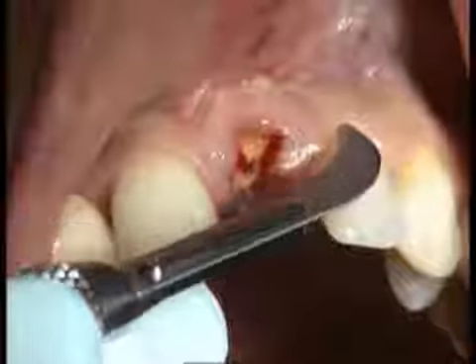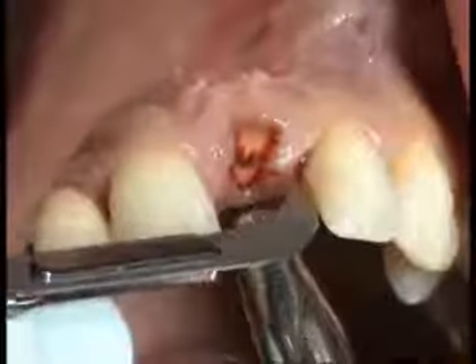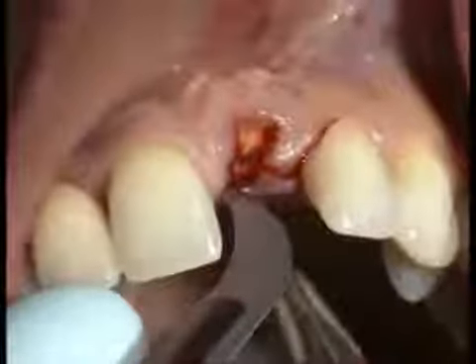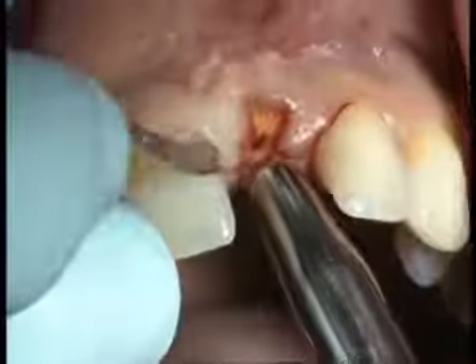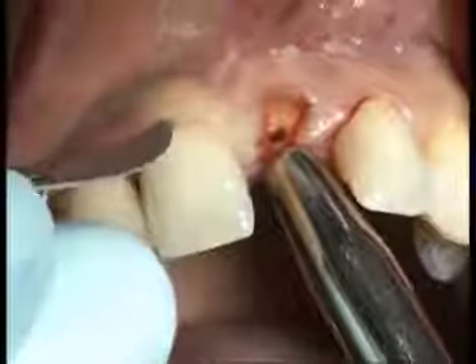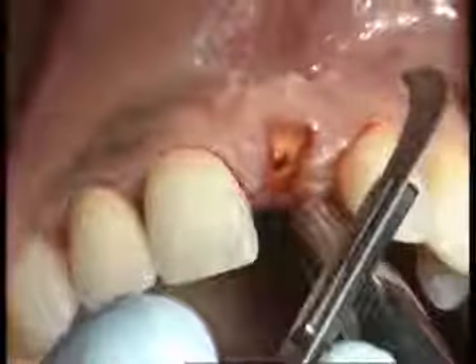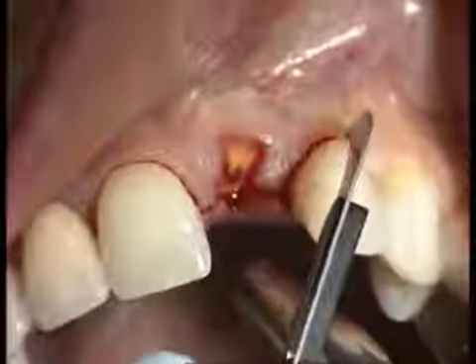To gain access to the alveolar ridge, a ridge incision is made. The papillae are separated proximally, with the incision continuing in the sulci of the adjacent teeth. Finally, the incision is extended vestibularly by vertically divergent relief incisions.